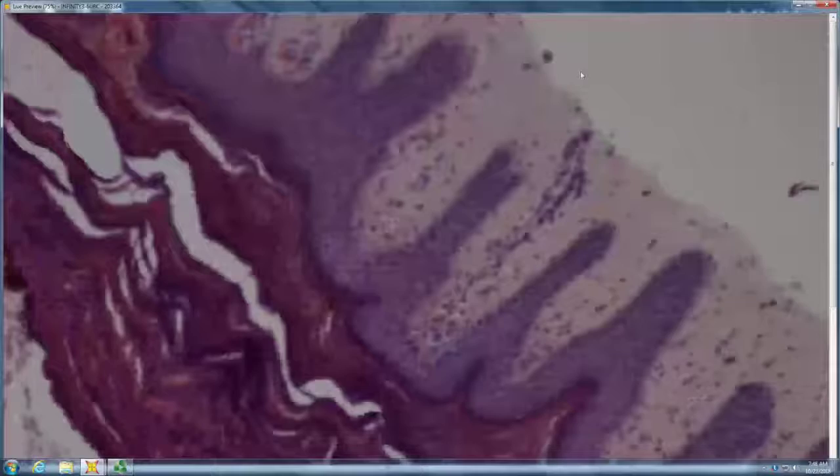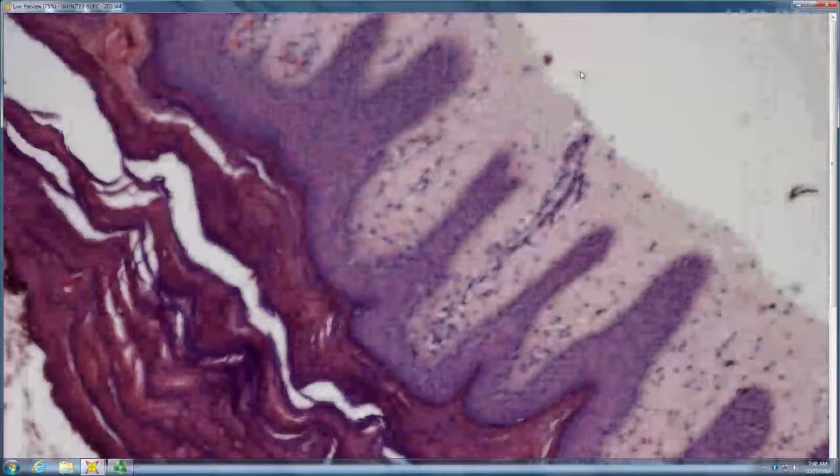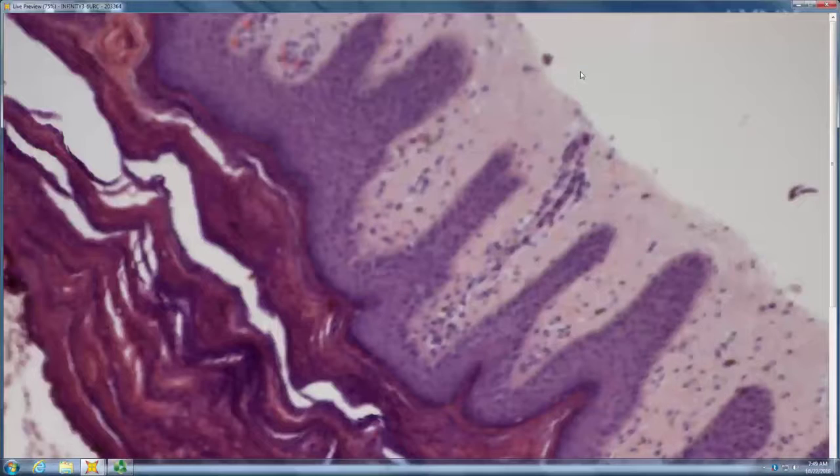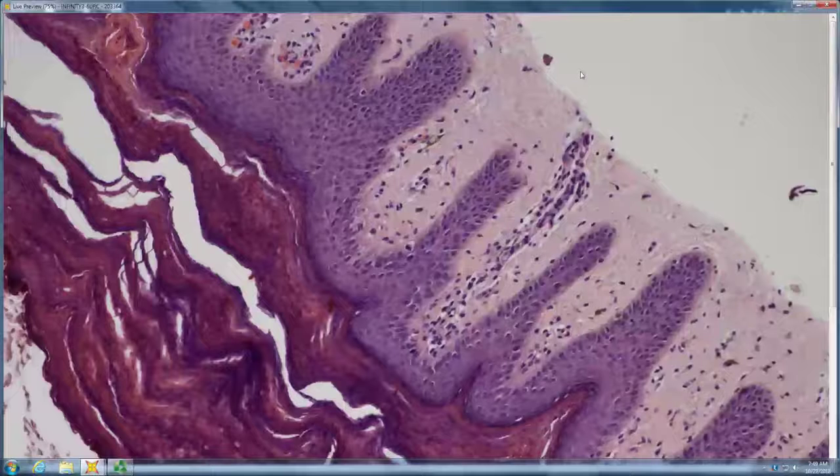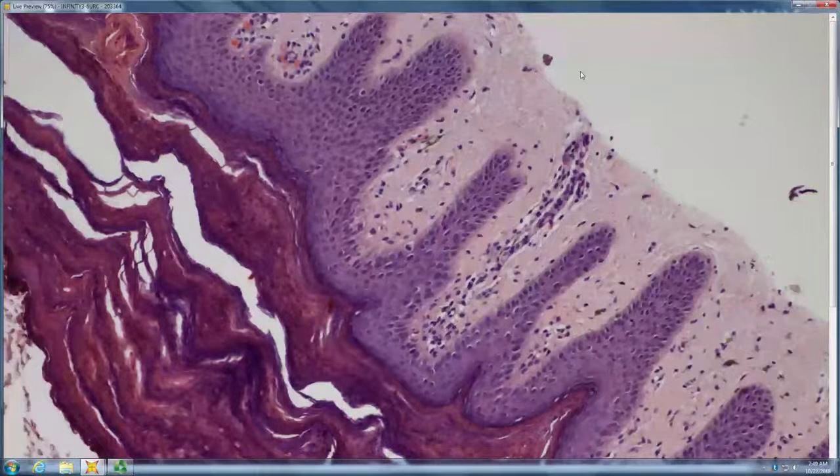Lots of hyperkeratosis with what looks like grains in them. Okay. So blue granules and hyperkeratosis. So do you know any form of granular parakeratosis? It's like granular parakeratosis. This is granular parakeratosis. Very good.